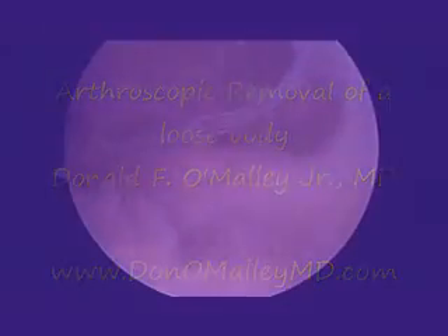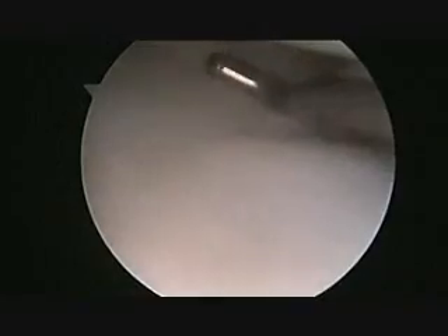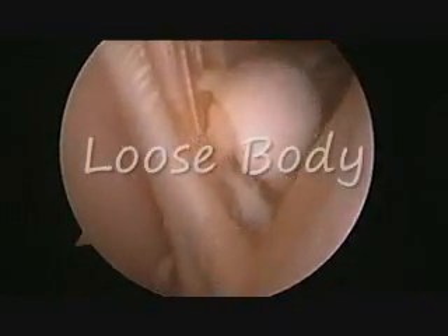Welcome to my instructional video on arthroscopic removal of a loose body from the knee. After the arthroscope is placed into the knee, a systematic examination of the knee including the suprapatellar pouch, ACL, PCL, synovial gutters, and the medial and lateral menisci are examined both visually and manually.